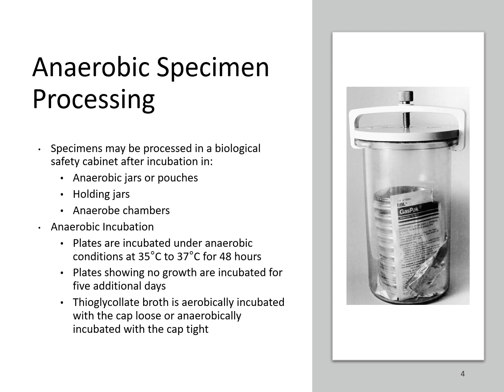Once they're cultured, those plates are incubated in anaerobic conditions at 35 to 37 degrees Celsius for 48 hours. After that time, they're taken out and examined for growth. If there's growth, it's worked up. If there's no growth, then it may be incubated for a little bit longer to try to detect those slow growers. And then those cultures will also be inoculated into a thioglycolate broth.